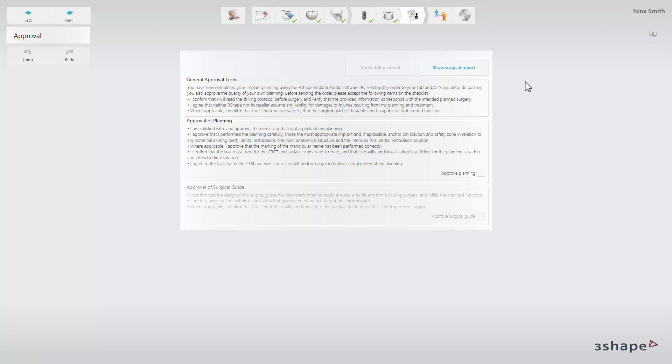When you have finished planning the case in Implant Studio, you can approve the implant planning and the surgical guide that you have created. You can also review the surgical report.